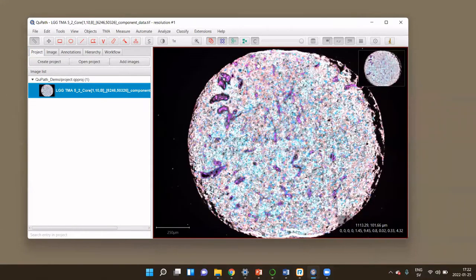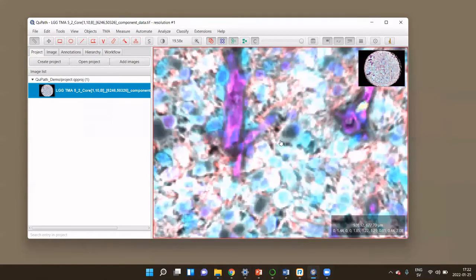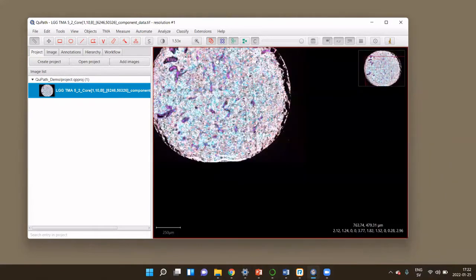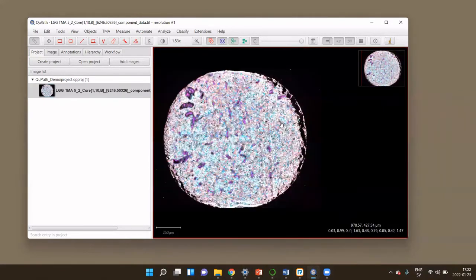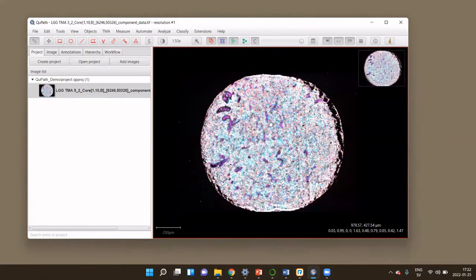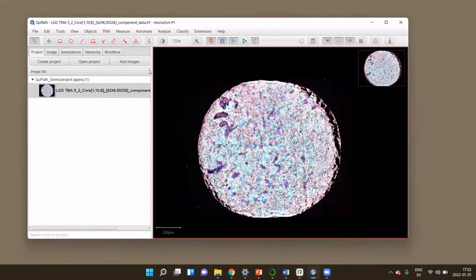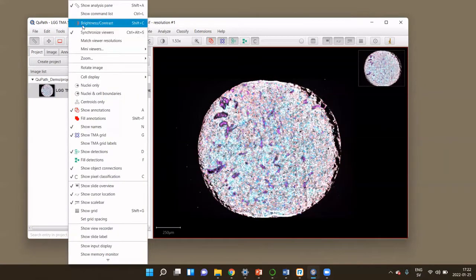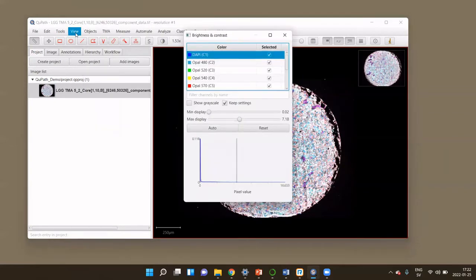You can now see the tissue core. You can zoom in by scrolling with your mouse wheel, pan and move it around, and also look at the single channels.